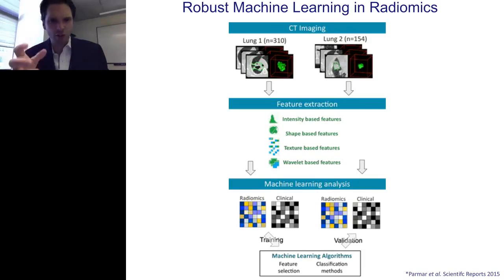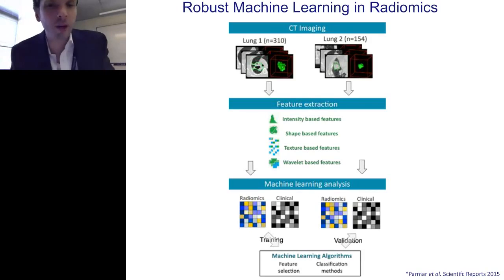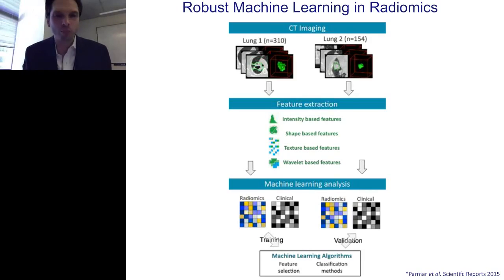Then we did the machine learning and the training. We had different radiomics methods that we evaluated, and we linked it back to clinical outcome, to survival data, to see how prognostic these biomarkers were, and also which method works best. So once we have defined these biomarkers, only these biomarkers were applied to the validation data set, and the performance was assessed independently.